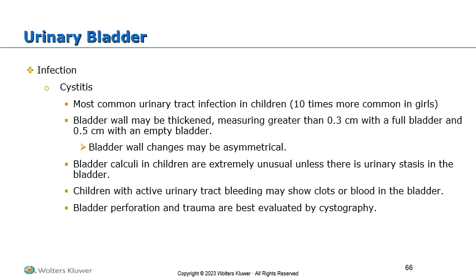We don't know necessarily without further investigation if that clot or blood is coming from the bladder itself or if the bladder is holding what's come down from the kidneys. Bladder perforation and trauma are not best evaluated by sonography.